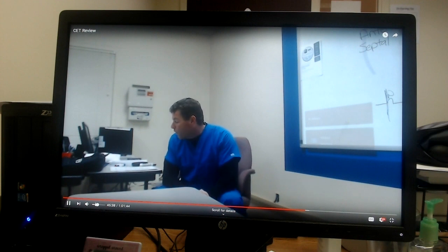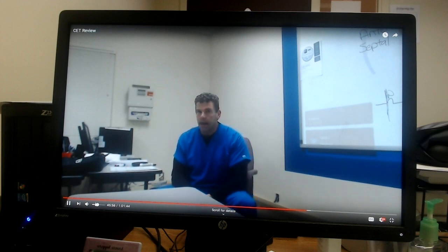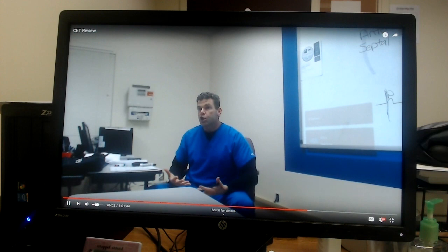85. Which of the following is an appropriate action for a technician to take to ensure accuracy when performing a 12-lead? You're right. Resolve artifacts from the EKG prior to showing the provider. That's why when we did those in class, if they were a little bit sketchy, I said, that's not diagnostic quality, remember? It's got to be nice and clean. So resolve that if we have to reposition the leads or tape them down or shave them or whatever.